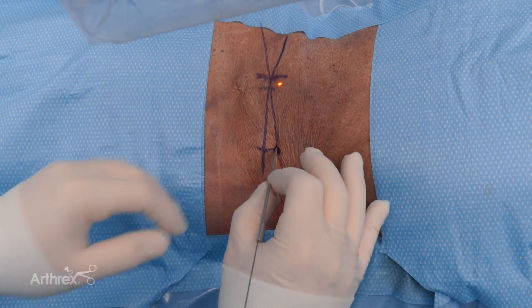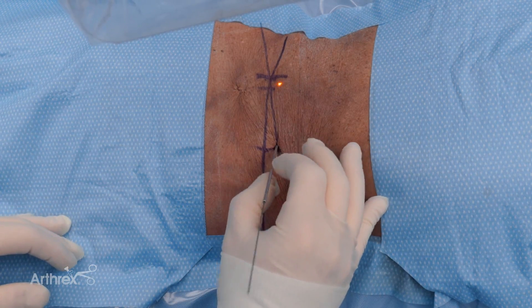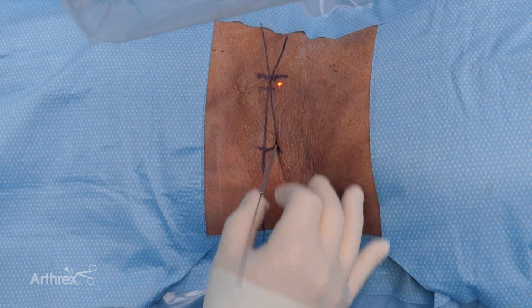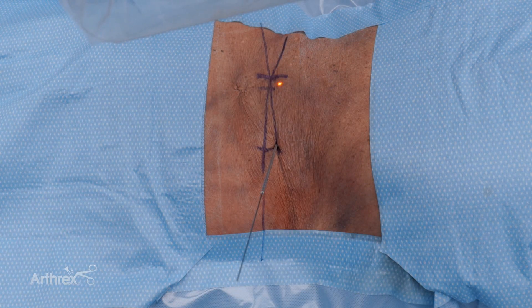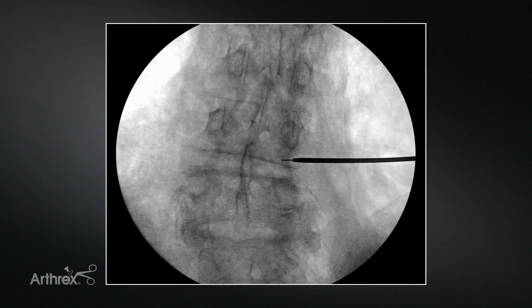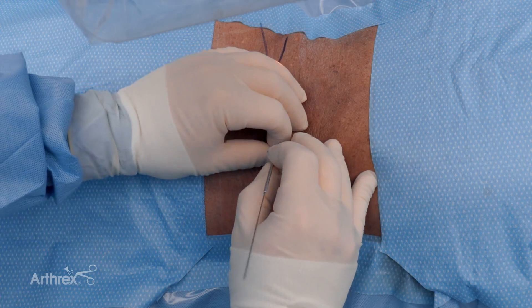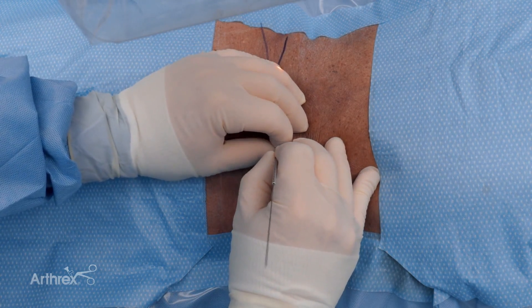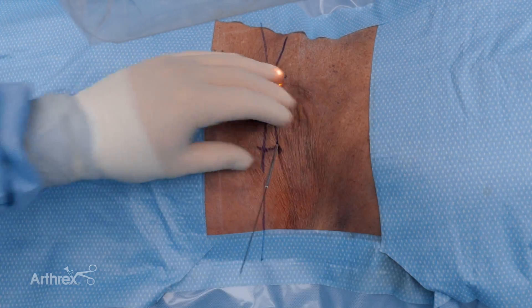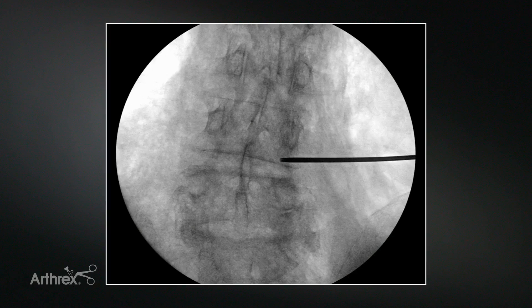These sequential dilators allow you to pass through the fascia and paraspinous muscles and feel the facet. It helps to rotate these as you advance them. We see that the first dilator stood off from the end of the guide wire — this suggests we're hanging a little bit on the facet joint. I'm going to try to give a little bit of downward pressure and rotate, and I can feel myself drop into the foramen. We're right at the medial pedicular line. Basically, what that's done is created an opening in the transverse process-facet capsule confluence and pushed into the foramen.